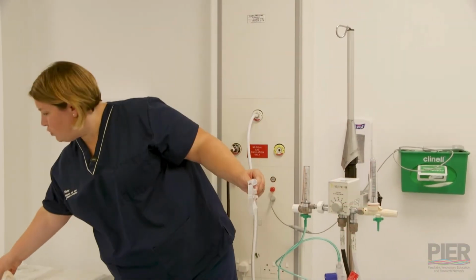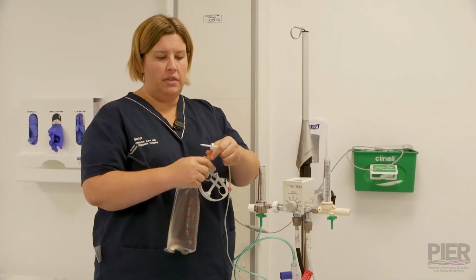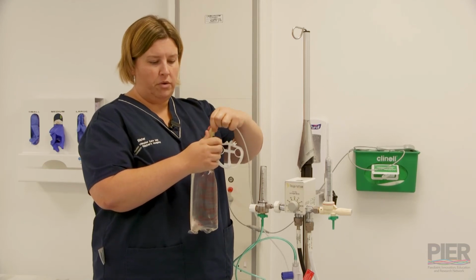So we'll attach the water to the humidification chamber. The spike just pulls out, and then obviously you're going to take it off and attach your water in to be able to provide water into the unit.